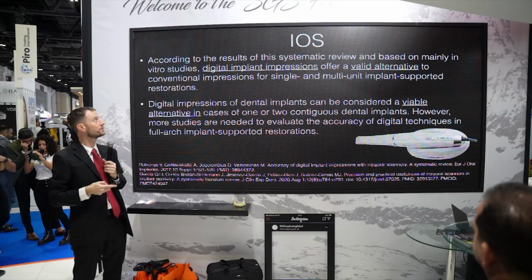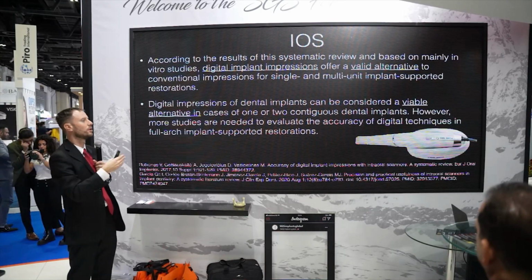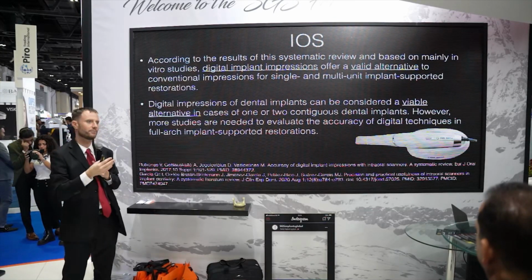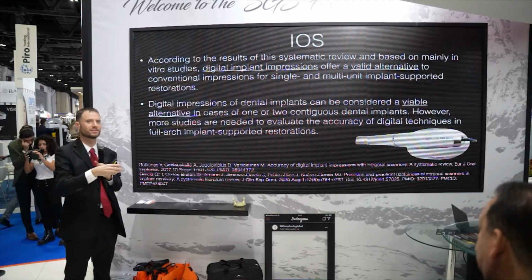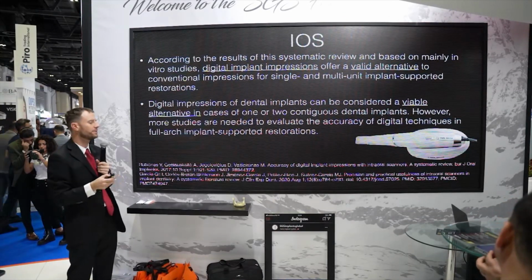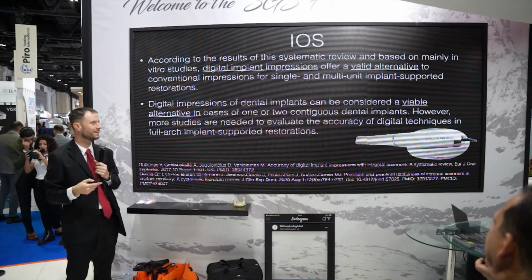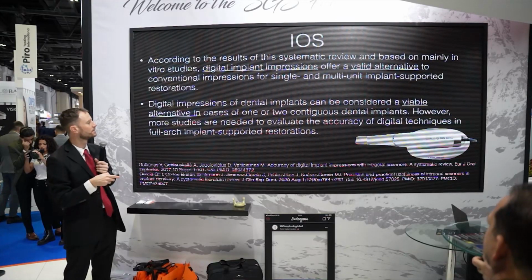The scanner, what we're talking about now, what I can show you here, is basically an option in the market now. We have different scanners. I can see hundreds of scanners being produced now. I think what is important is some of the features of the scanner. It's not the branding, it's more about the features.